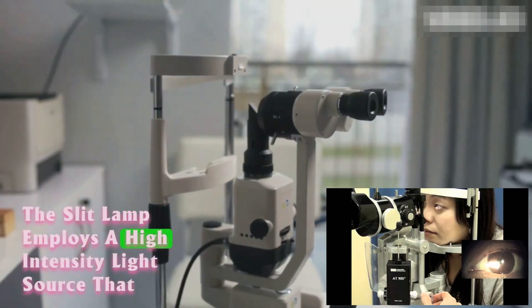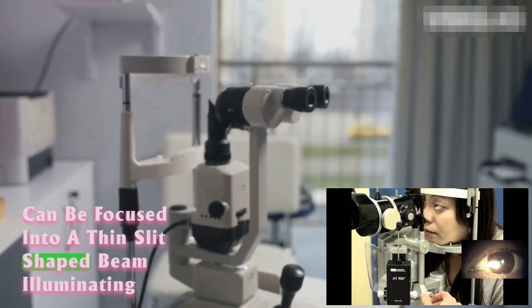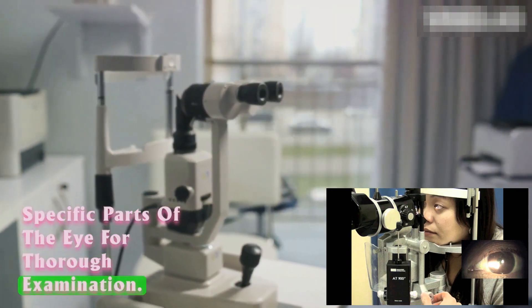The slit lamp employs a high-intensity light source that can be focused into a thin, slit-shaped beam, illuminating specific parts of the eye for thorough examination.